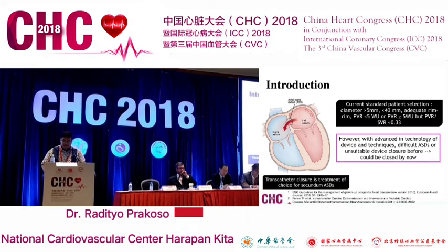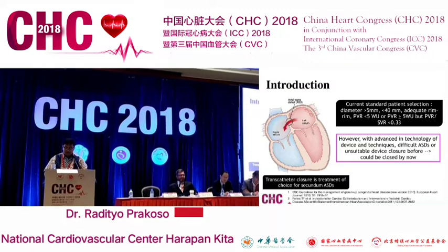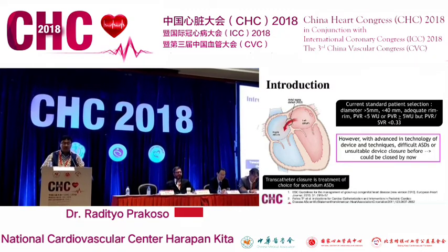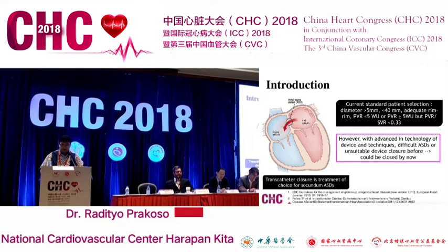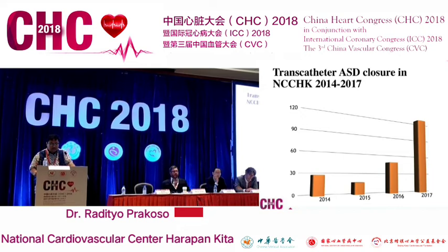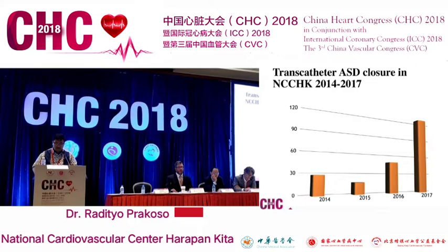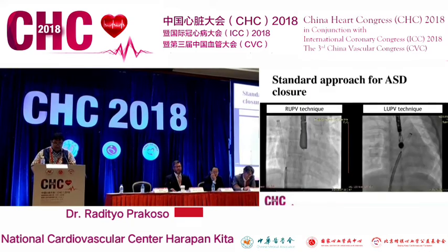However, with the advance in technology of devices and techniques, the difficult ASD, unsuitable for device closure before, can be closed right now. So this is the emergence of transcatheter closure in my center. It has been increasing in the last 2 years.